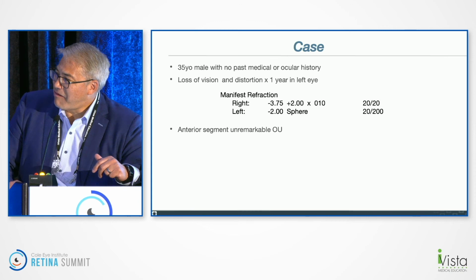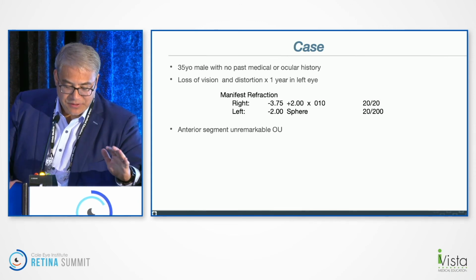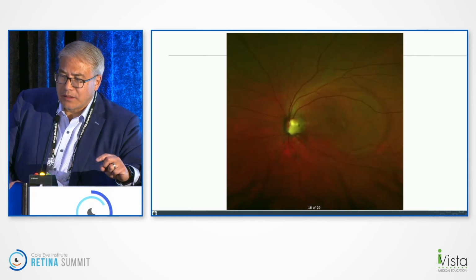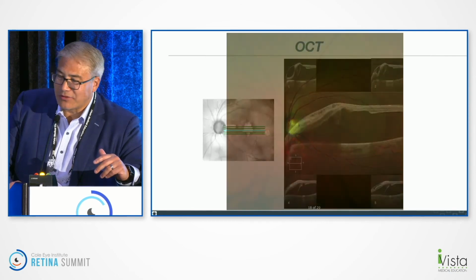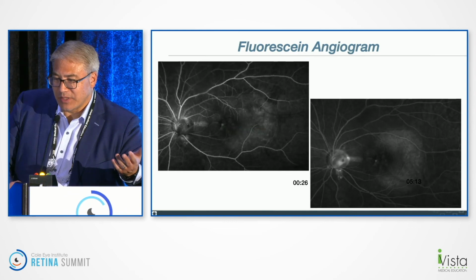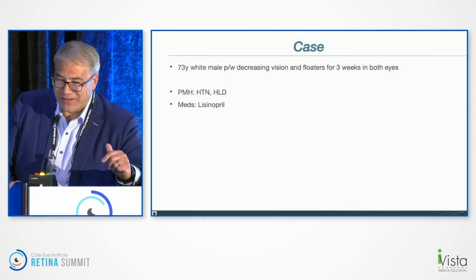Green channel analysis. So distorted vision, loss of vision. You got it already? Yeah. Wow, she's fast. Justice should have got this in a millisecond because it's his patient. Didn't, but just showing you different aspects of an optic nerve pit.